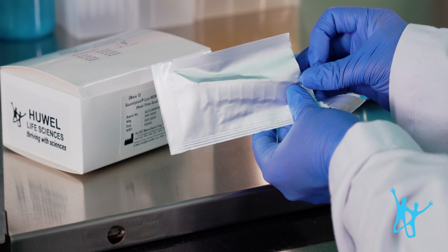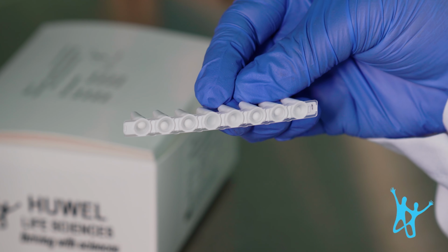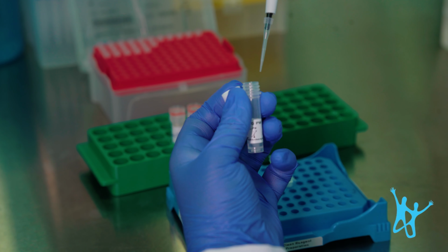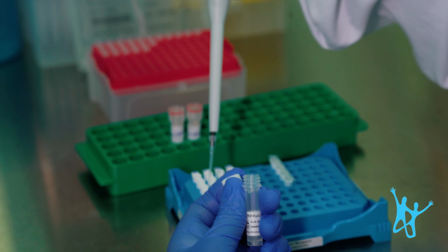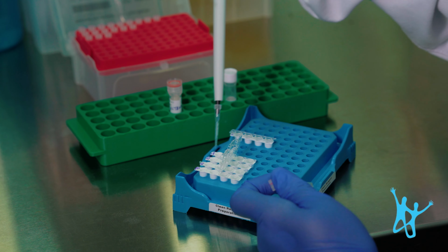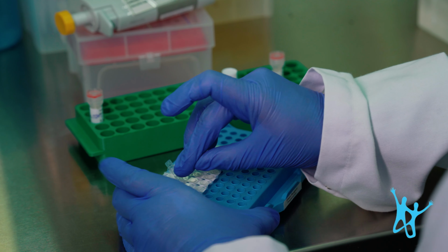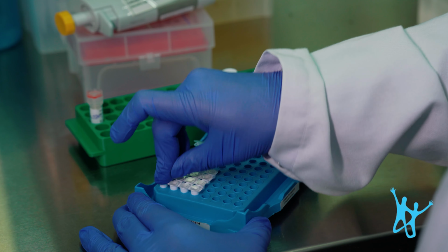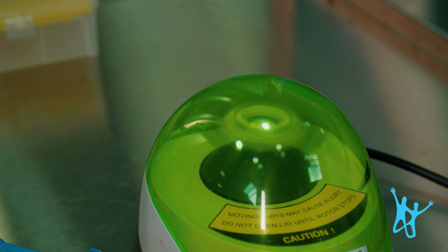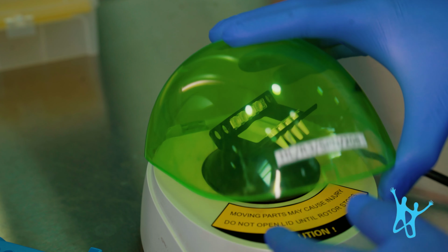Take the PCR tube containing the lyophilized MDR-TB amplification bead. Add 20 microliters of the prepared lysate directly into the PCR tubes containing the lyophilized amplification beads for MTB and drug resistance detection. The bead will dissolve to form the complete PCR reaction mixture. Close the PCR tubes securely. Briefly centrifuge to remove air bubbles before loading into the thermal cycler. Include positive and negative controls in every run to ensure accurate results.